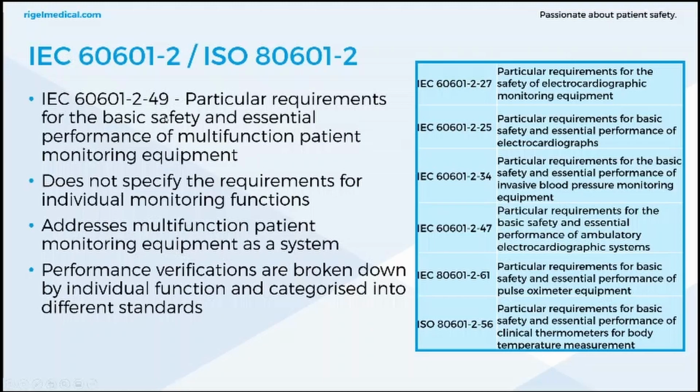Now, IEC 60601-2-49 establishes the basic safety and essential performance of a patient monitor, but it does not specify the requirements for individual monitoring functions. It addresses multifunction patient monitoring equipment as a system. Performance verifications are broken down by individual function and categorized into different standards. And here's a couple of examples of these standards down on the right too. For invasive blood pressure monitoring, it's got its own collateral standard. Electrocardiograph performance, again, it's got its own standard, and so on and so on.